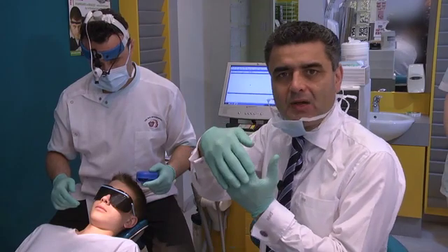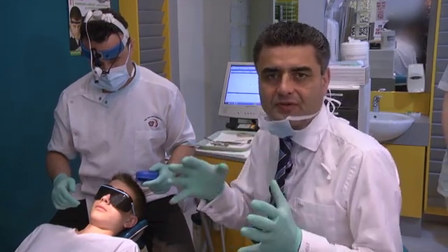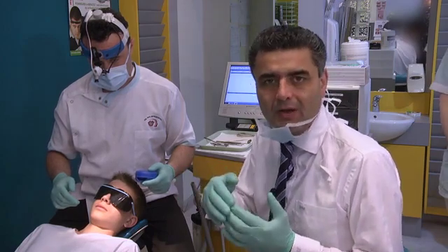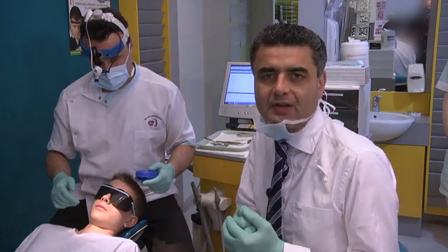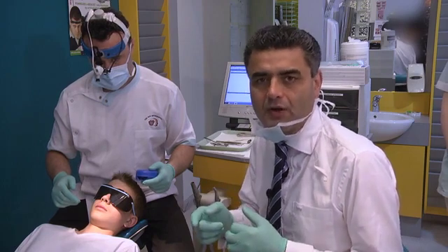Oliver had a very deep 100% overbite and we treated him with some upper arch development with 2x4 mechanics, and we've opened the overbite. Now to maintain that overbite as we wait for full eruption of permanent dentition, I've asked Oliver to wear a bionator at home and at night time.